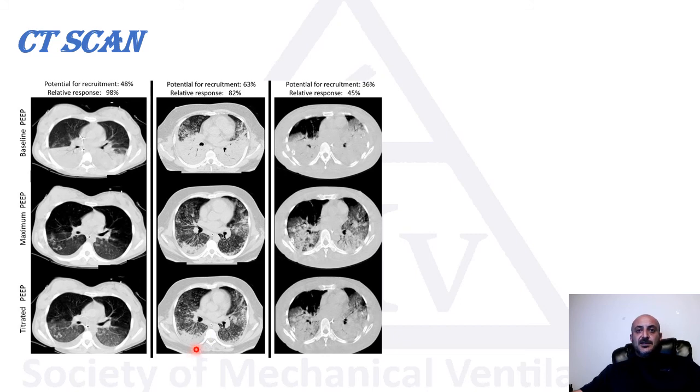And in that right side, this is a patient who's not even PEEP responsive. So as you can see here, that was after the recruitment maneuver. We hyperinflated this. The consolidation still looks pretty bad in the basal areas, and as we're titrating the PEEP, there are still collapsed areas. So again, very hard to do in clinical practice, mostly in studies and research.